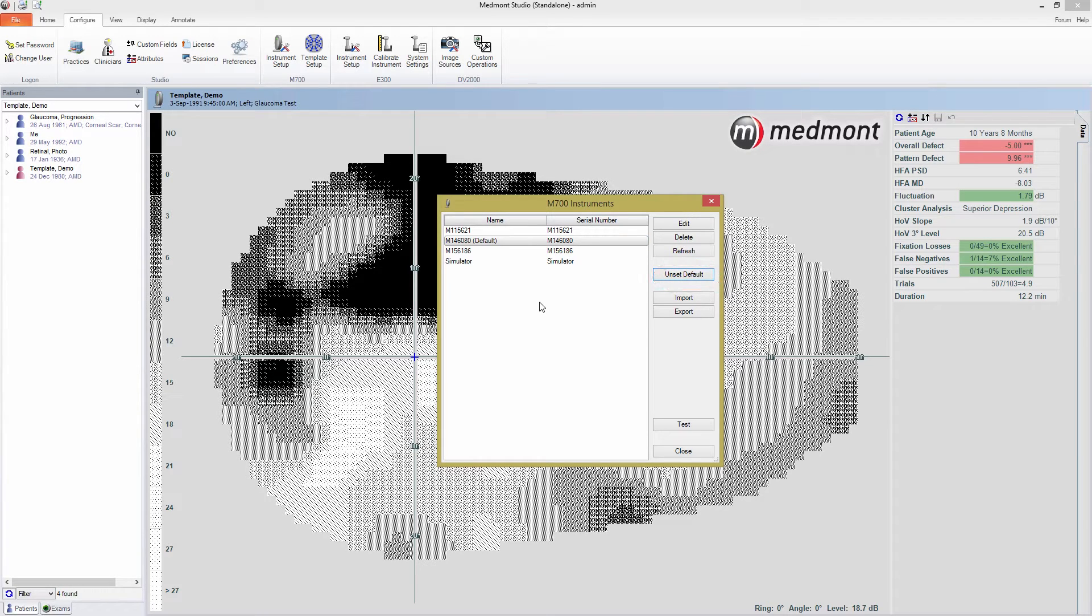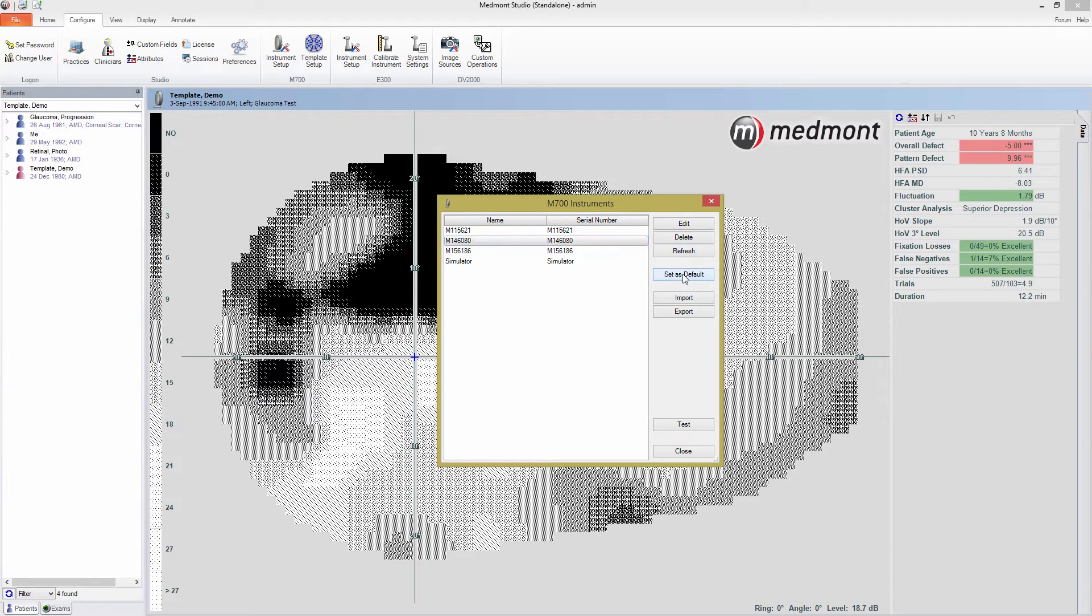However, if you are using a perimeter other than your default, you can return to this window and unset the default, which allows you to select the perimeter to use at the beginning of each test.